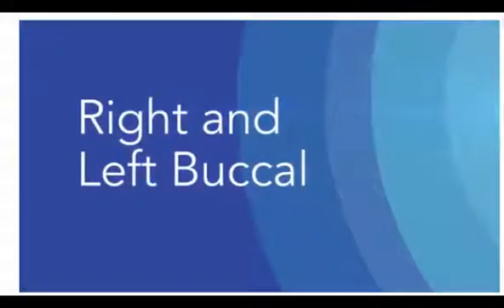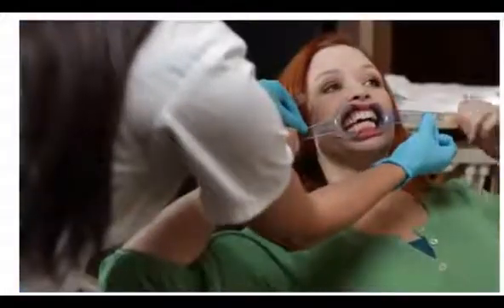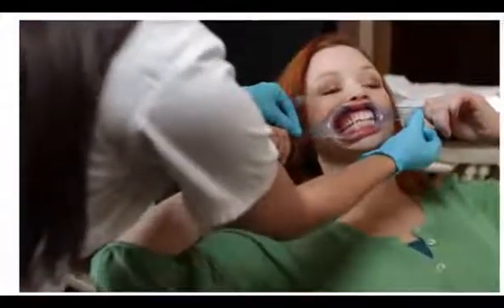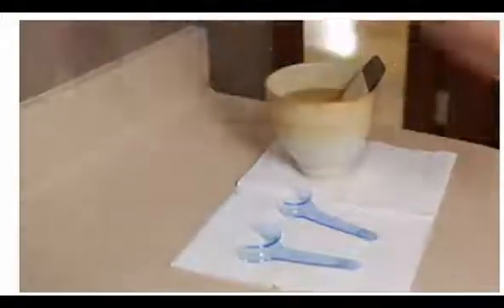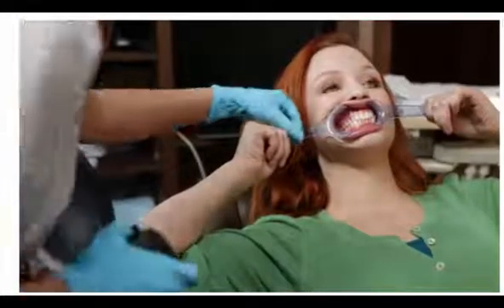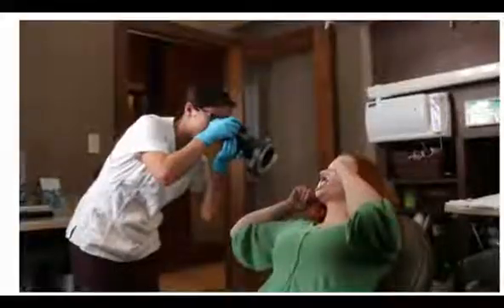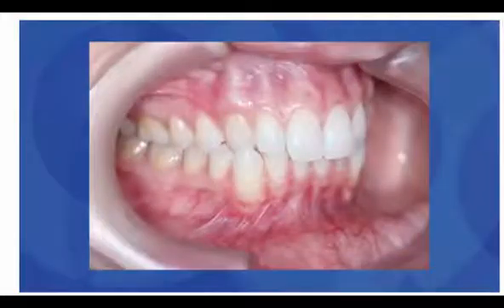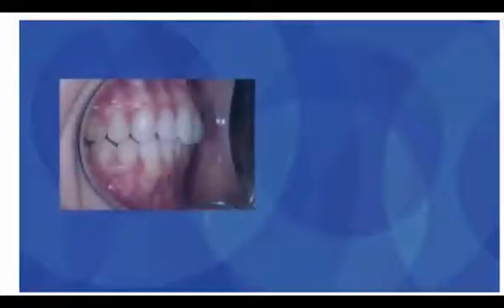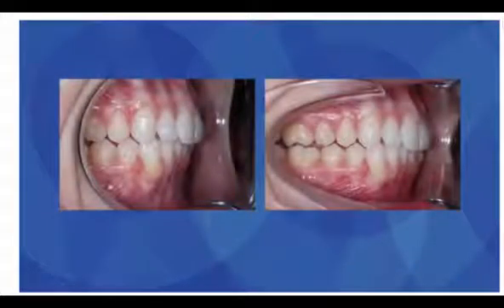The right buccal photo is next. With both cheek retractors in the mouth, have the patient bite down, then pull back on the right retractor while relaxing the retractor on the opposite side. Assist the patient with retraction if needed. This will allow more of the molar region to show on the patient's right side. Position the camera perpendicular to the buccal segment. If there are issues exposing the second molars in the buccal photos, the use of narrow, more V-shaped retractors may be needed.